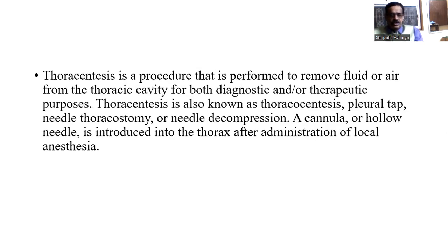Thoracentesis is a procedure that is performed to remove fluid from the thoracic cavity for both diagnostic and therapeutic purposes. It is also known as pleural tap, needle thoracostomy, or needle decompression. A cannula or hollow needle is introduced into the thorax after administration of local anesthesia.